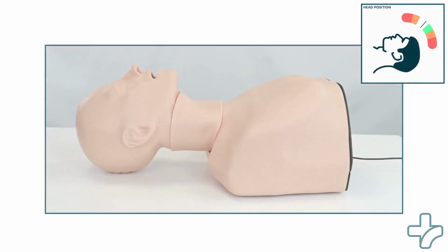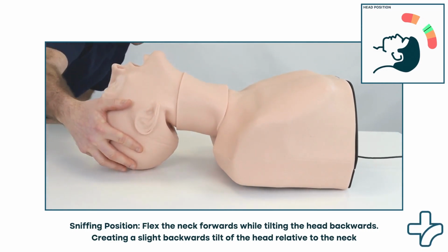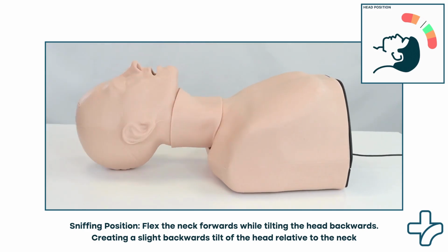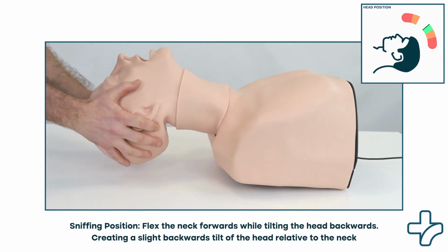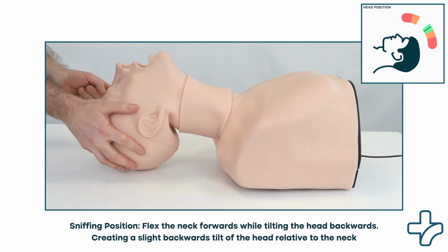To achieve the sniffing position, gently elevate the patient's head using a pillow or towel roll placed under the occiput, if necessary. Simultaneously flex the neck forwards while tilting the head backwards. This creates a slight backward tilt of the head relative to the neck.